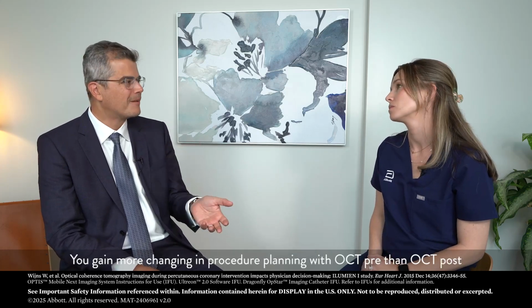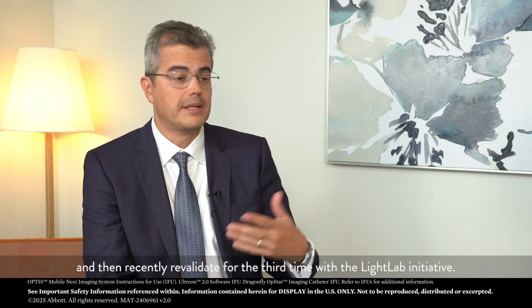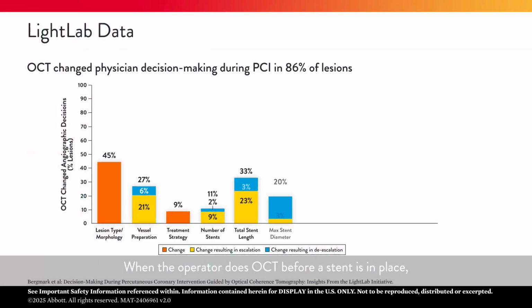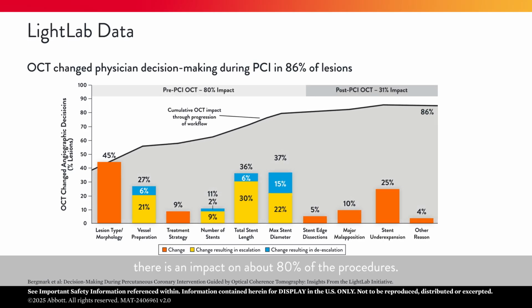You gain more change in procedure planning with OCT pre than OCT post. And then recently revalidated for the third time with the Light Lab initiative. Similar findings, very consistent. When the operator does OCT before a stent is in place, there is an impact on about 80% of the procedures.